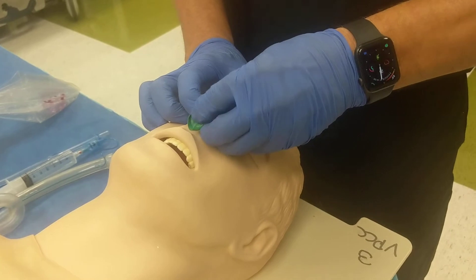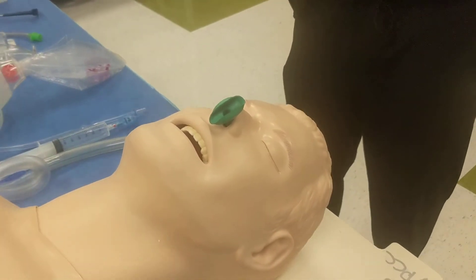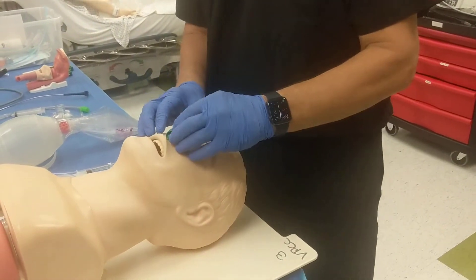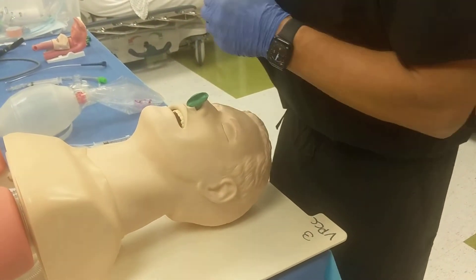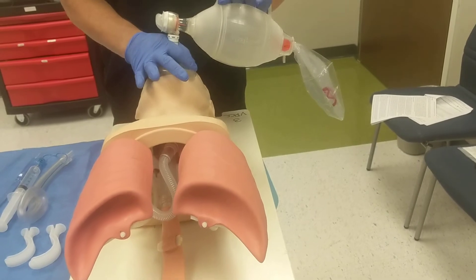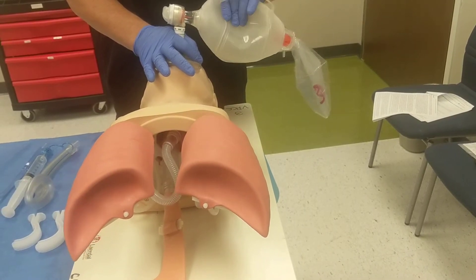It should go completely without resistance all the way to the trumpet. If you meet resistance — as in all things we insert in body cavities — stop, reassess. You may have a deviated septum and have to go to the other side. Once this is in, if the patient is breathing spontaneously, we would hope to hear non-sonorous breathing. If we were having to use an ambu bag before, we can still do so with this in — it does not inhibit our ability to create a tight seal. We can breathe the patient through the nasopharyngeal airway without difficulty.